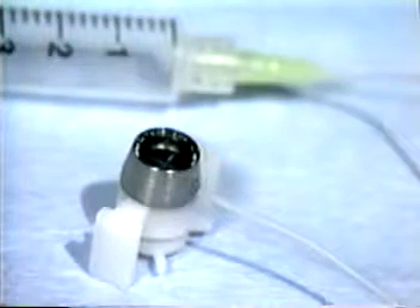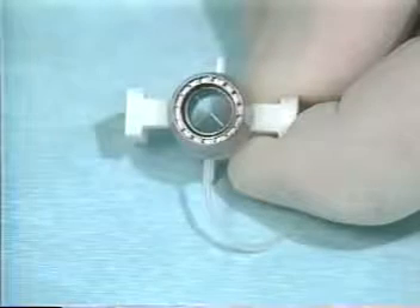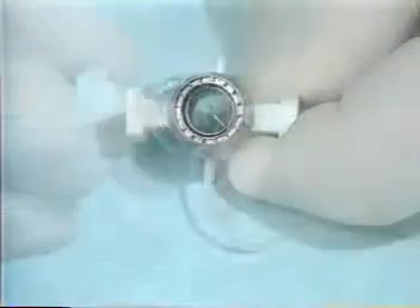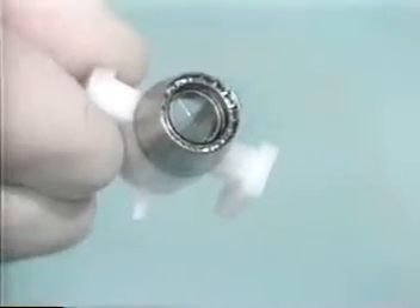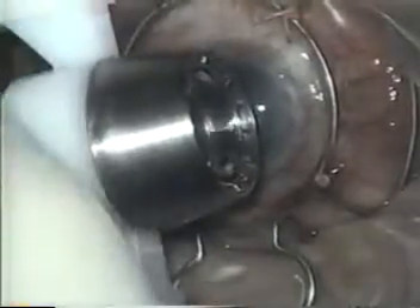The second part of the Barron system is the radial vacuum trephine, used to cut and mark the recipient cornea. It consists of a body and a blade assembly. The hollow walls of the body encase a vacuum chamber ending in 16 radial markers which will mark the cornea for suture placement. There are two plastic struts for holding and stabilizing the body. The vacuum chamber is connected by a small silicone tube to a syringe with a spring-loaded plunger. The blade assembly itself is made up of a movable circular blade, crosshairs for centering, and spokes which are turned clockwise to lower the blade and make an incision or counterclockwise to retract it. For each spoke turned, the blade is lowered or raised six hundredths of a millimeter.